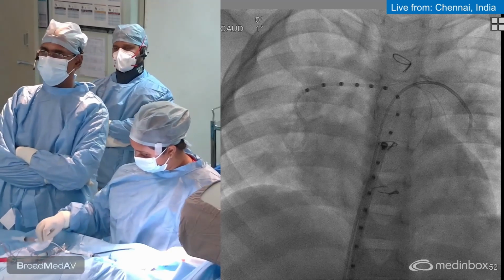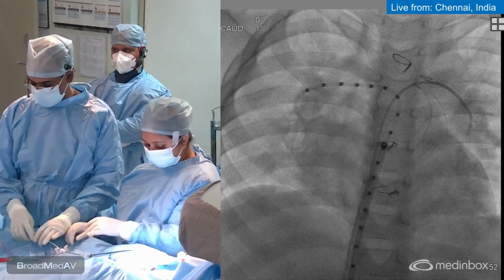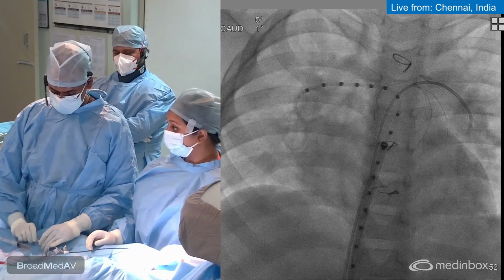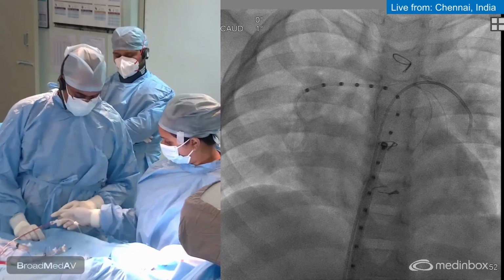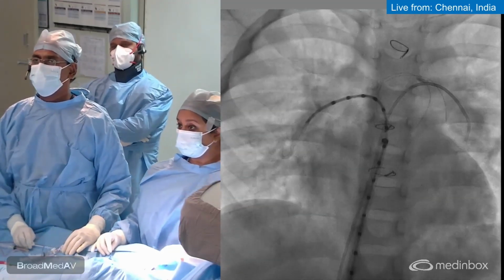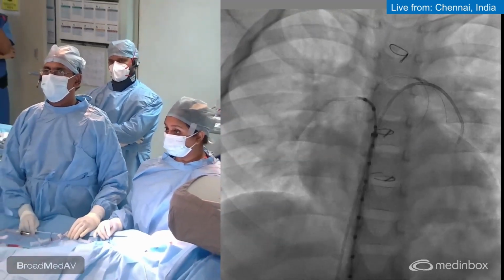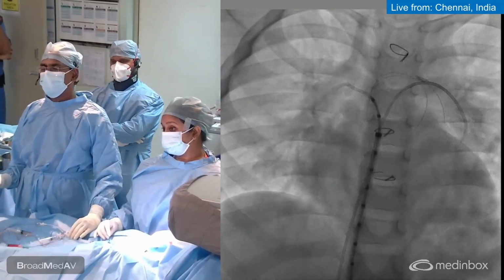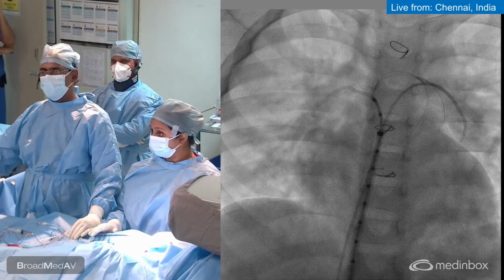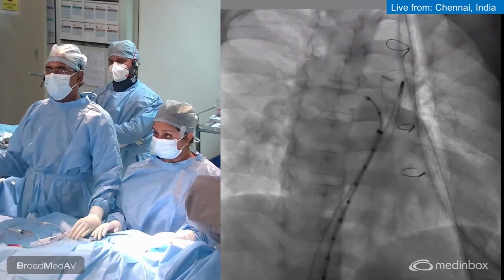We have positioned our catheter across the right. I'm going to withdraw the right pulmonary artery pigtail and probably give an angiogram. What is the view you are choosing for angiograms in this case, sir? In a patient with LeCompte like this, what is the better view? Yeah. So the pulmonary artery here will be coursing from anterior to posterior, as well as from the midline towards the right. So we'll give a right anterior oblique for the right pulmonary artery and left anterior oblique for the left pulmonary artery.